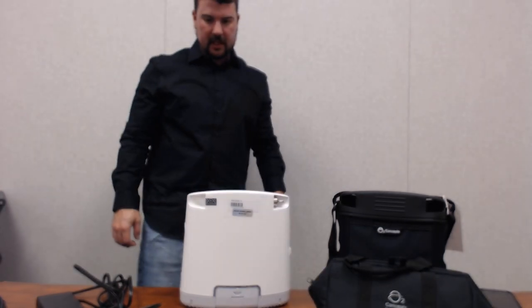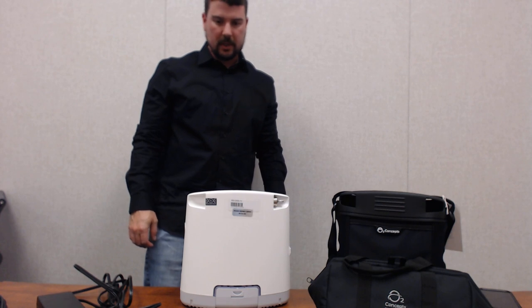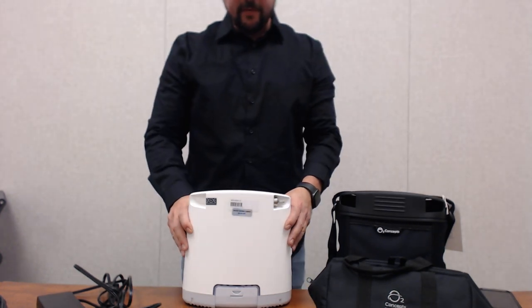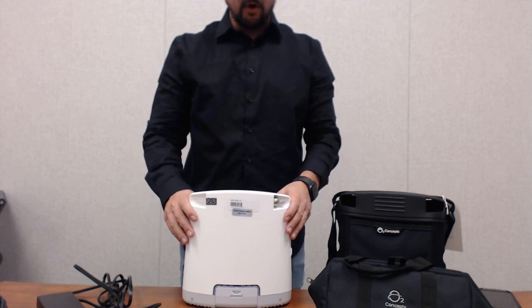I'd like to visit with you today to discuss the Oxlite Liberty Portable Oxygen Concentrator. Here in front of me I have the device itself and the accessories that go along with the unit.